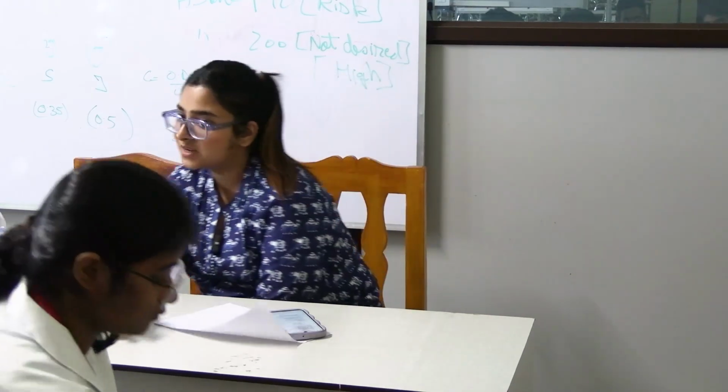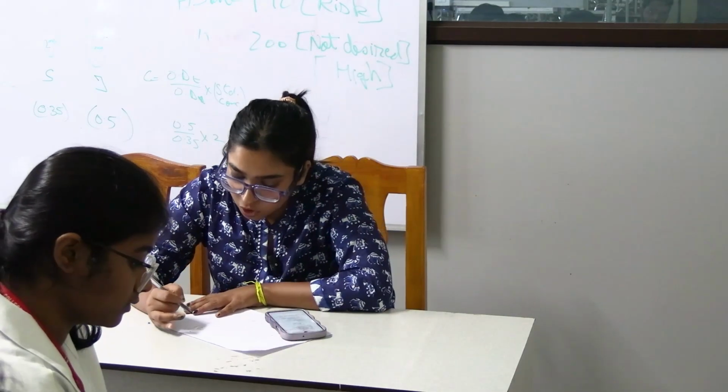Both are present over here, respiratory and metabolic. Respiratory acidosis and metabolic acidosis. Nothing is compensated. Nothing is working. Respiratory and metabolic acidosis is present in this case. But I think for your level, if you can detect that both are present, that is very well and good. Or if you can't, just say what is more prominent. What is more lowered over here?